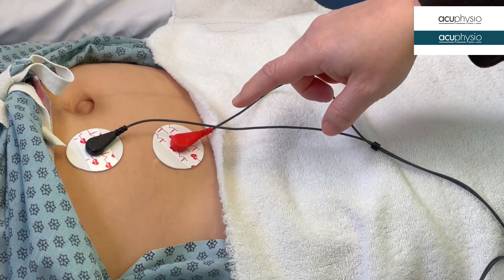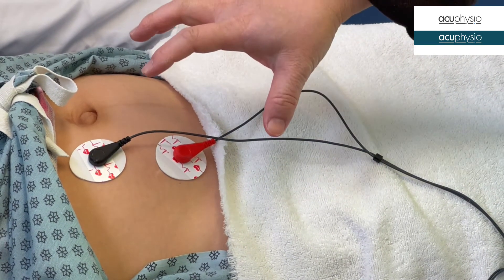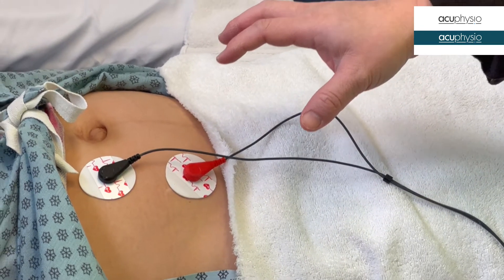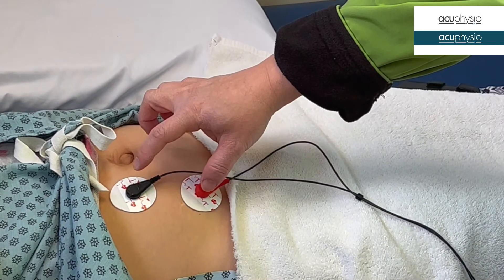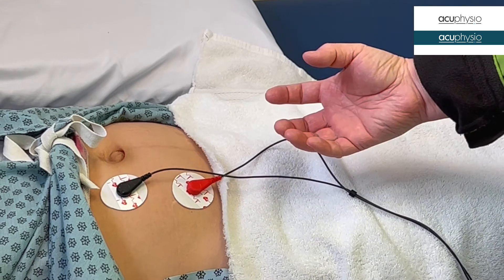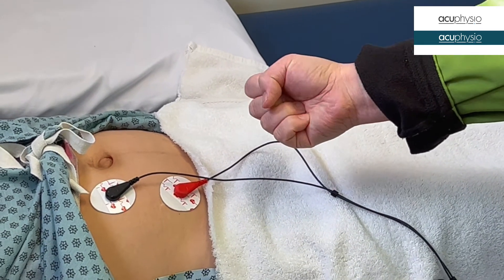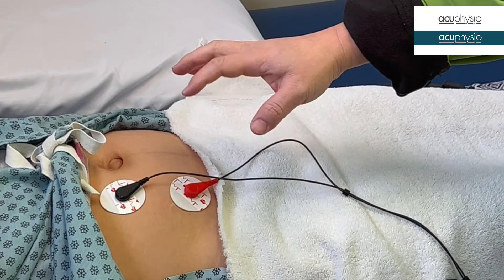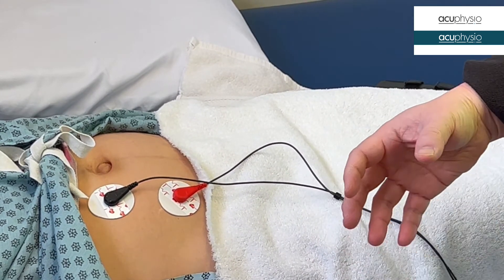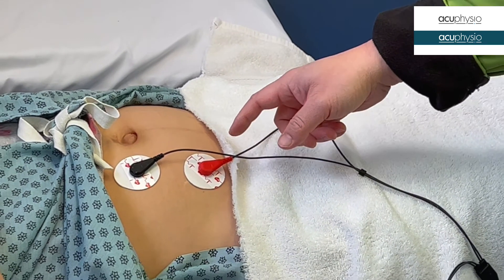When we are doing the pelvic floor, one group of sensors is going to be on the abdominal area. This is to monitor the contraction of the abdominal muscle. When we are training the pelvic floor contraction, we do not want them to push this area. Otherwise you're creating what we call a paradoxical contraction. On one hand, you want to encourage the patient to contract the pelvic floor muscle. But on the other hand, you want the abdominal muscle to relax. If it doesn't relax, you have a pushing force concurrently happening together and that will defeat the purpose. This is one of the more maladaptive contractions that happens for people with pelvic floor dysfunction.